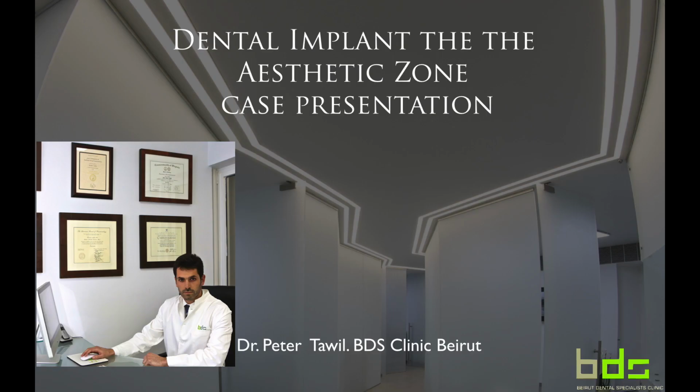Hello, I'm Peter Tawil, and today I'll be presenting to you a case of a fractured central incisor replaced with a dental implant in the aesthetic zone.